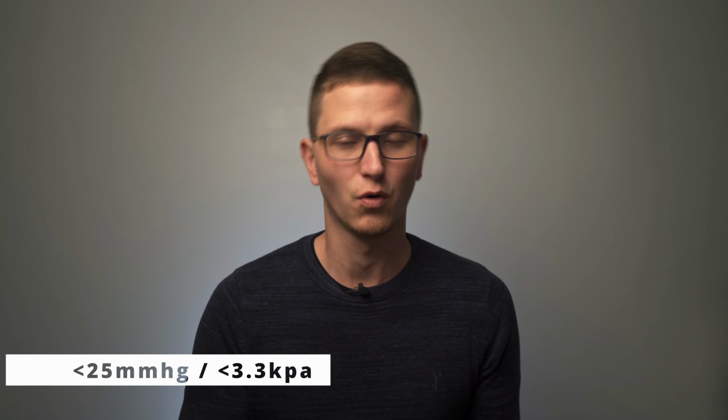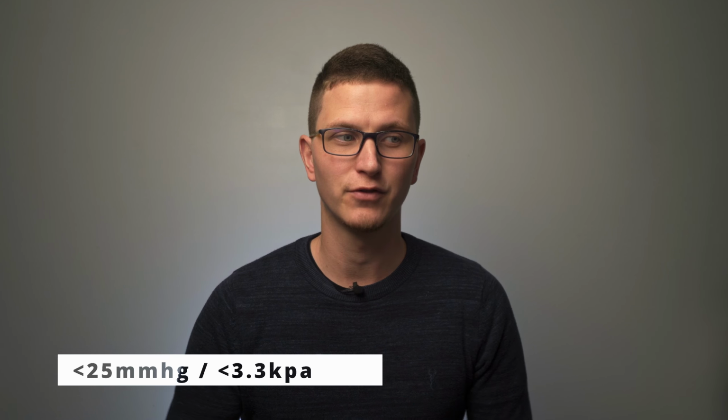So the next time you come across someone who's quite poorly, they've got really high sugars, they're breathing quite fast, and they're not in shock, because obviously if we have someone in shock, their ETCO2 will be low. So they're not in shock, they're breathing fast, and they've got hyperglycemia. Assess their ETCO2. If it is less than 25 or 3.3, you have a really good indicator of DKA. I thought that was quite interesting.